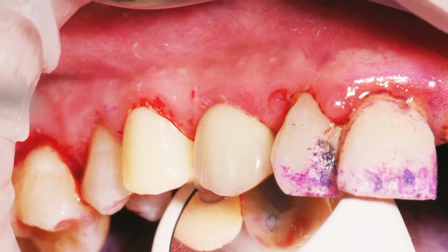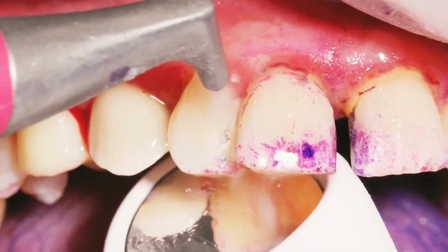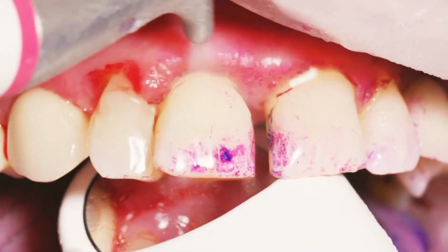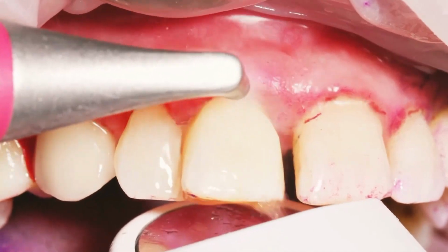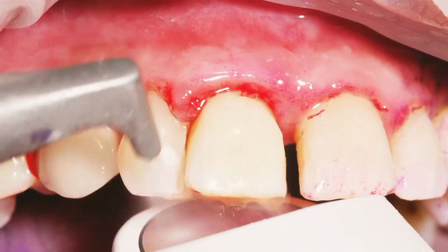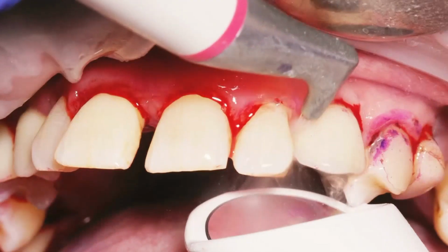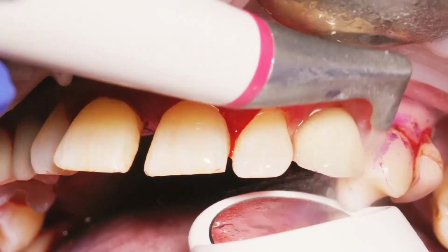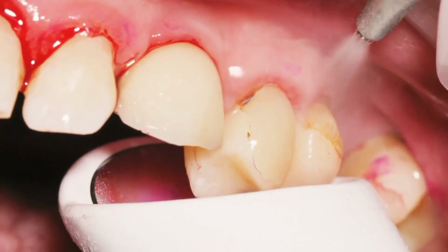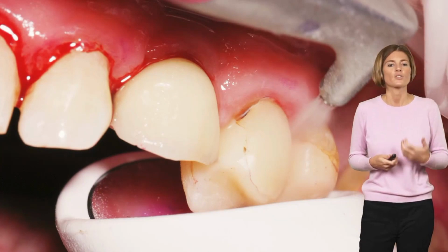Use the PS tip, or sometimes if you need some angulated tip, you can use the PSR or the PSL to have an advantage in terms of position to get the sides. And of course, you can deliver the plus powder in the transmucosal tunnel and on the crown of the implant. So you can use the erythritol powder wherever, on the ceramic, composite.